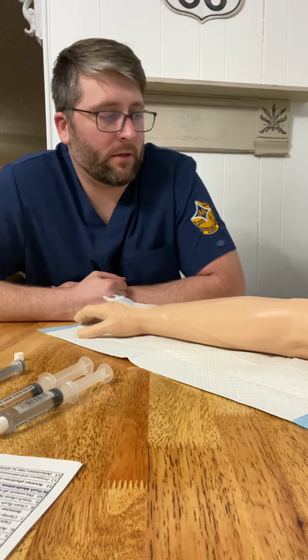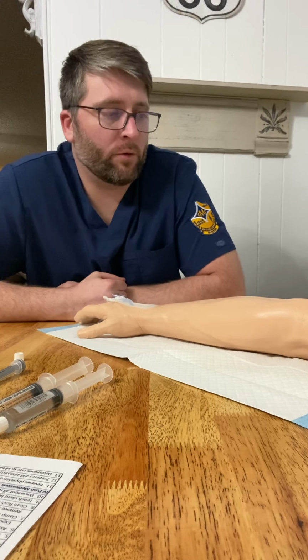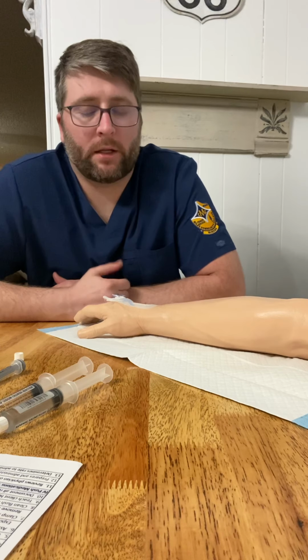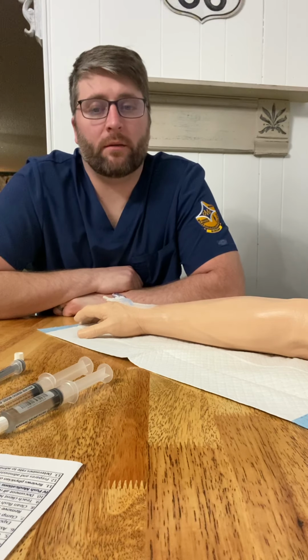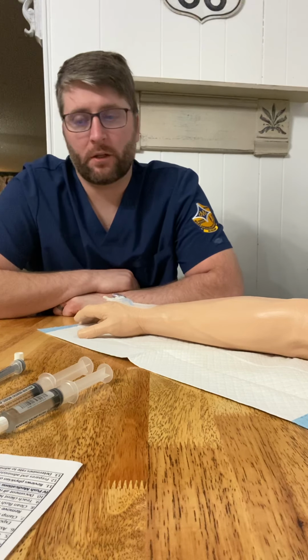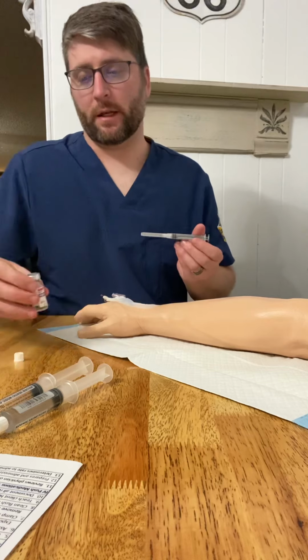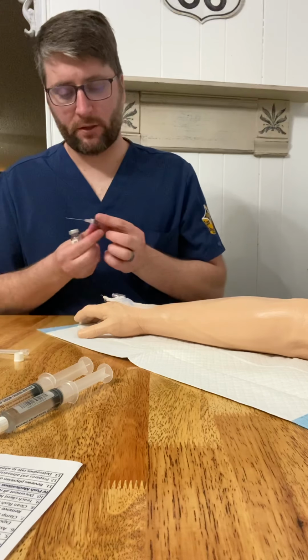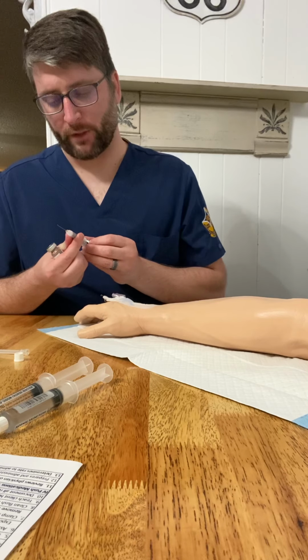Hey, Ivy, doc has ordered that we do a push medication through the saline lock. We're going to review our physician orders and our MAR to give this medication. So we're going to do our 3-check method. We're going to determine the rate of the medication for this IV push, which is going to be IV bolus, right now stat. The medication is 1 milligram, and it's 1 milligram per milliliter. So we're going to draw this up with the appropriate size needle and the appropriate gauge.